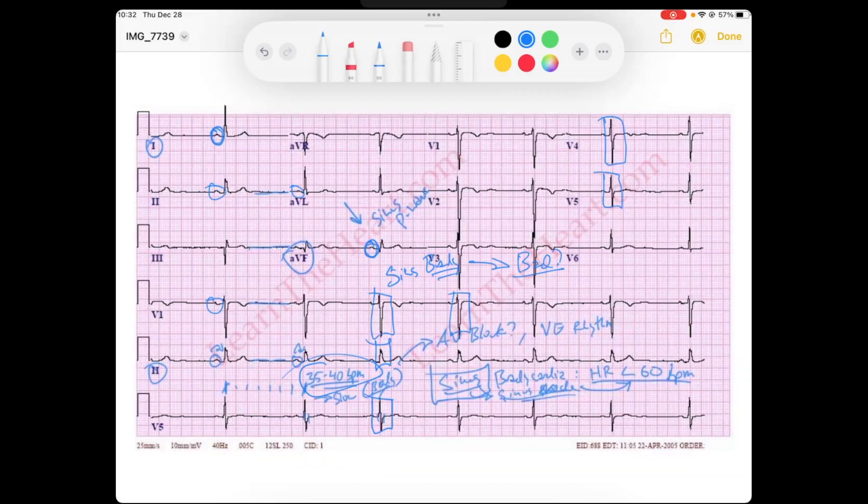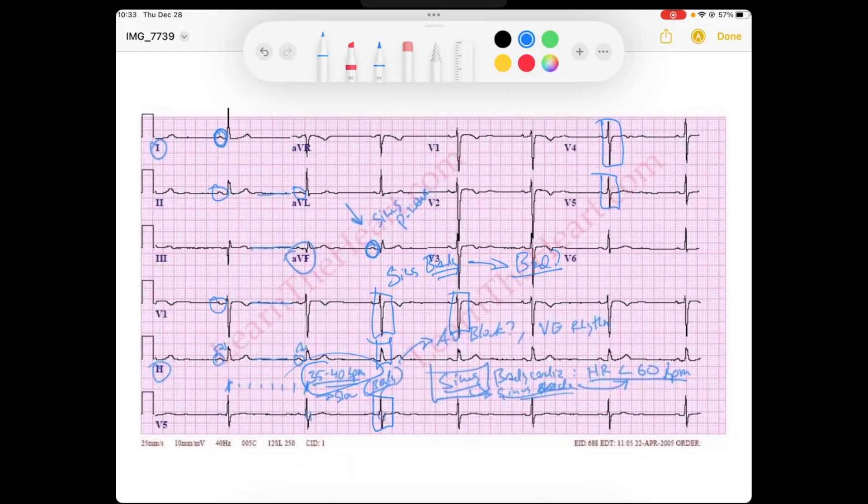And when you look at that P wave that is occurring before the QRS, you determine it's sinus, and you determine there's no AV blocks. And you look at the rate of sinus node firing, we said that that sinus node is firing quite slow, less than 60. So, we've got a sinus bradycardia.